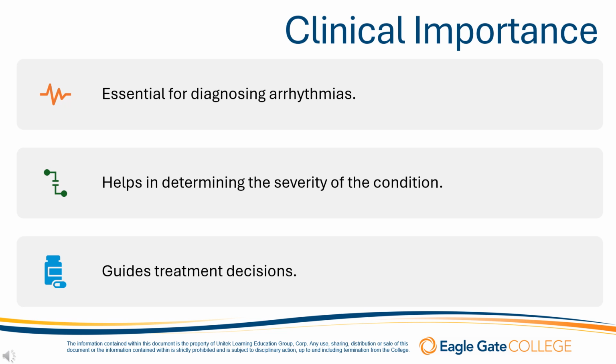Verify your calculations, especially if the heart rate seems unexpectedly high or low. Use multiple methods of calculating if necessary, and accurately document the heart rate, along with the method used to calculate it, in the patient's medical record for clear communication among healthcare providers.